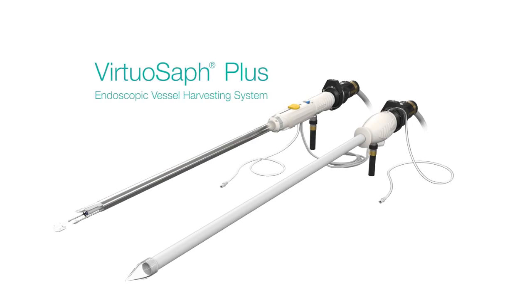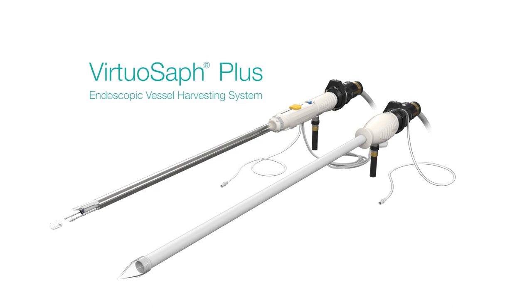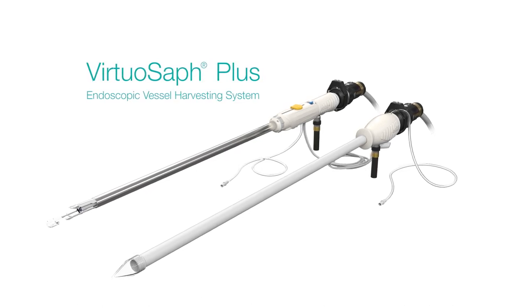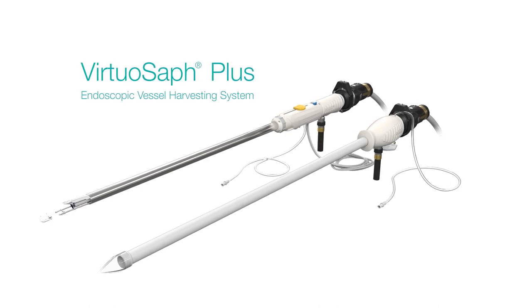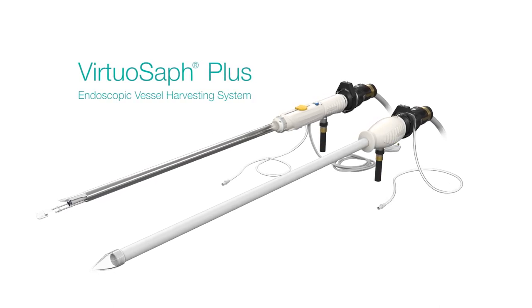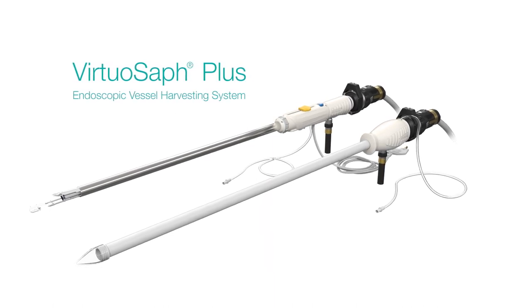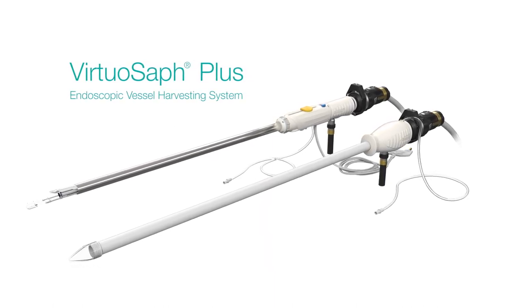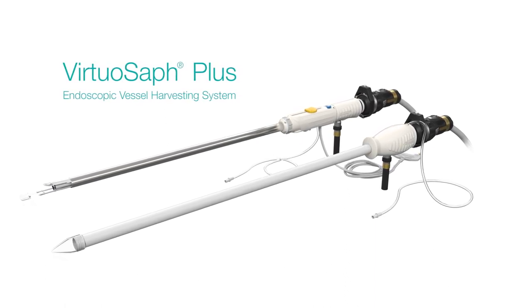Terumo Cardiovascular Group's VirtuoSaph Plus Endoscopic Vessel Harvesting System was developed through extensive research and experience. It is designed and optimized for successful vessel harvesting of both saphenous vein and radial artery. The design of the VirtuoSaph Plus integrates key design functions that contribute to the highest standards for patient safety and efficiency in the operating room.